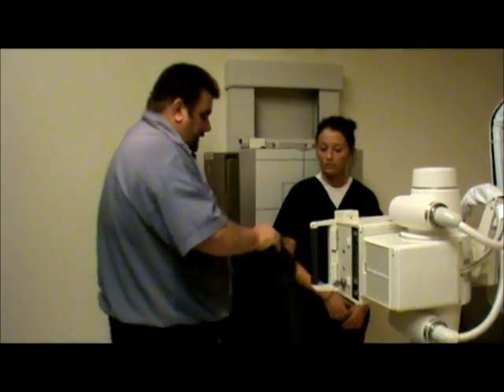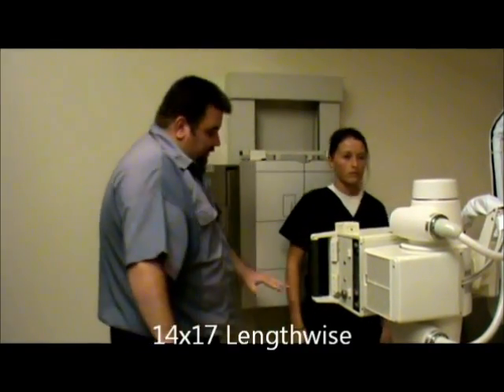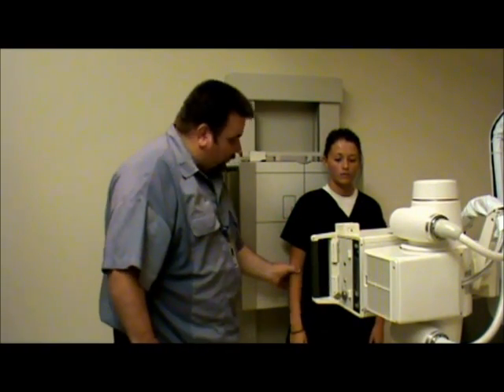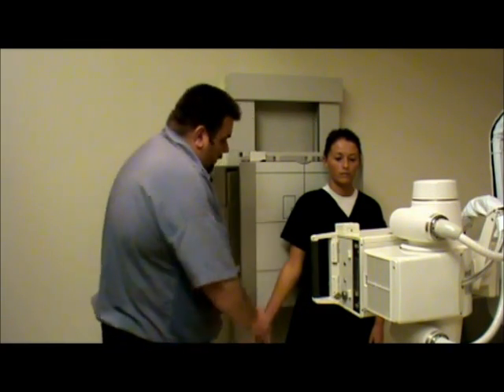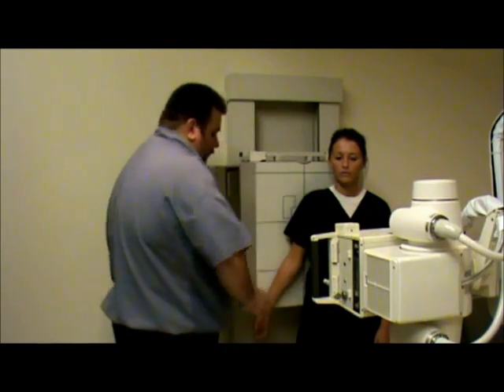We're going to put the shield on the patient, to the front. We're going to have the patient step a little off to the outside of the arm. We're going to have the patient rotate their arm so that the epicondyles are parallel to the IR, rotating slightly so that we can get the part closer to the board.